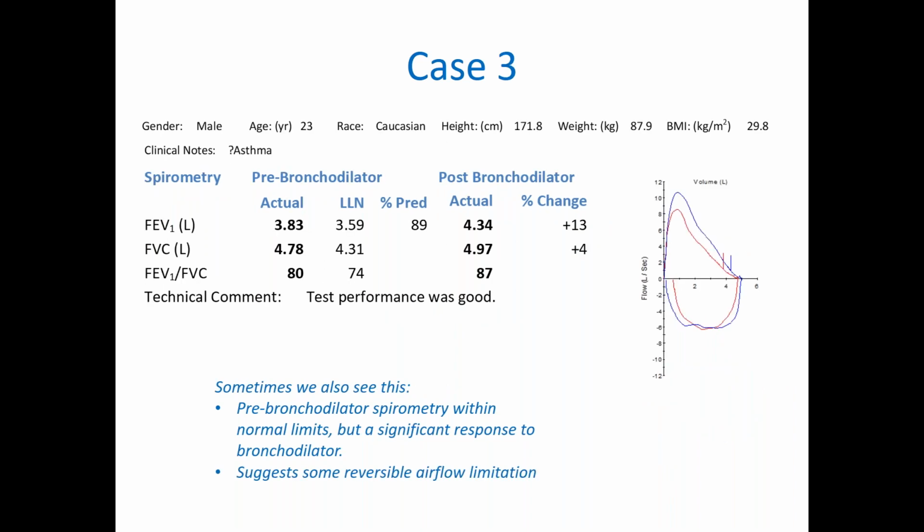Case number 3 illustrates a patient who we're querying asthma in, but when we look at their baseline or pre-bronchodilator spirometry, once again, it's within the normal range when you compare it to the lower limits of normal.